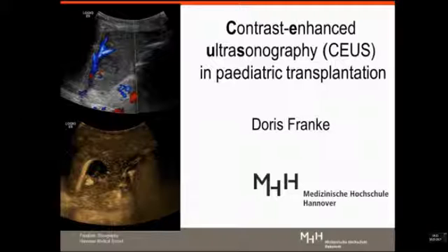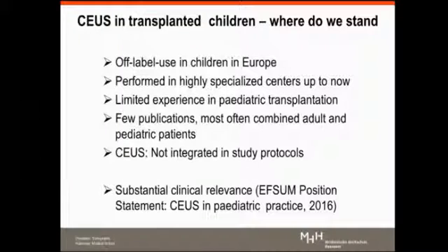So thank you very much, Paul. My talk is about pediatric transplantation. Where do we stand today? Off-label use is still a problem in Europe, and up to now, CEUS in transplanted children is only performed in highly specialized centers, and we have limited experience in pediatric transplantation. There are few publications, and most of them combine adult and pediatric patients, and it is not integrated in any of the study protocols. But we think there's really substantial clinical relevance, as stated by the EFSUMB position statement on CEUS in pediatric practice last year.